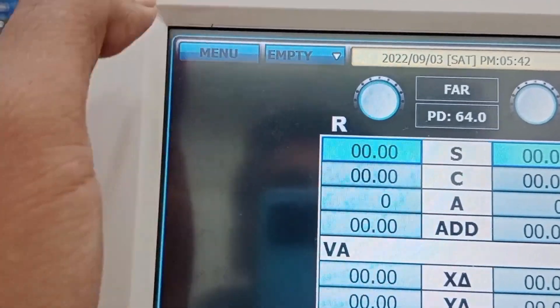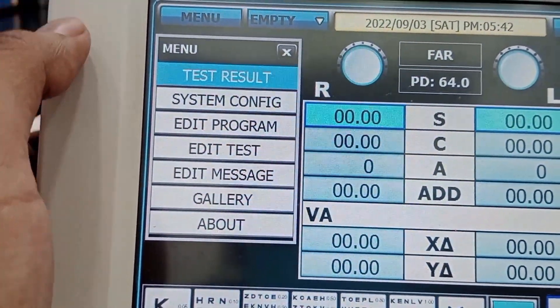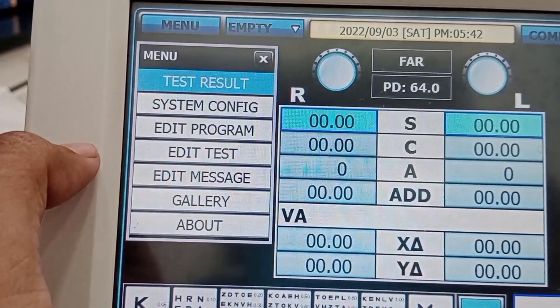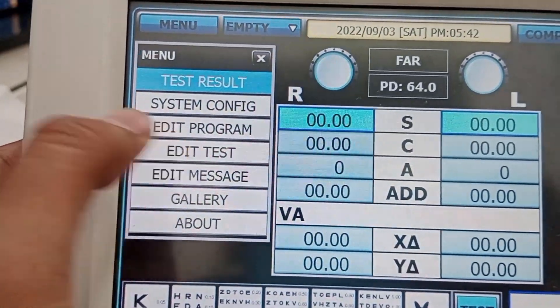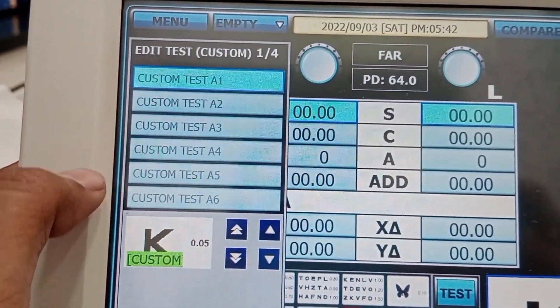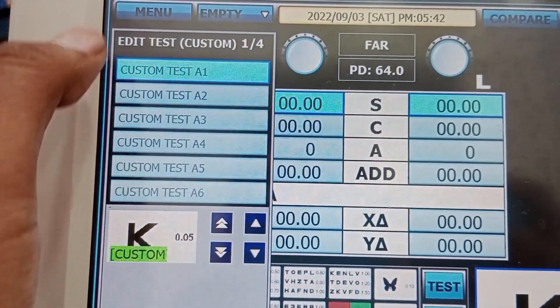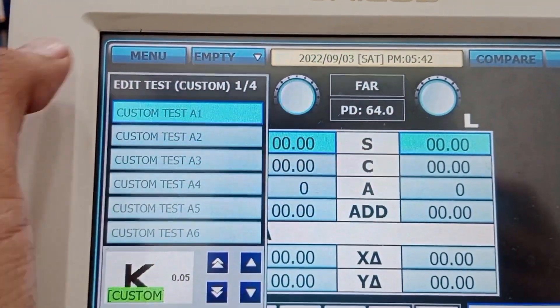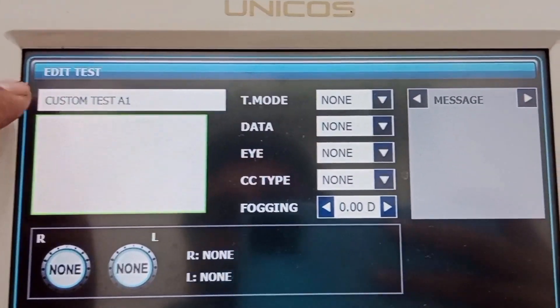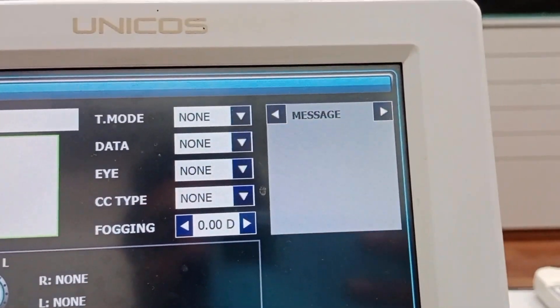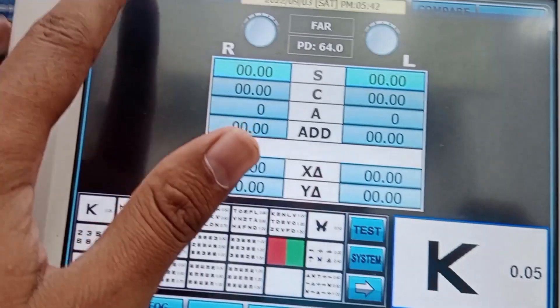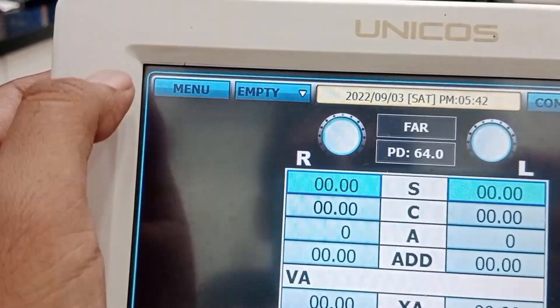Back in the menu, the next setting is edit test. You can change your saved tests here and modify the history of the patient with these tests. You can see here all the saved history of the patient.